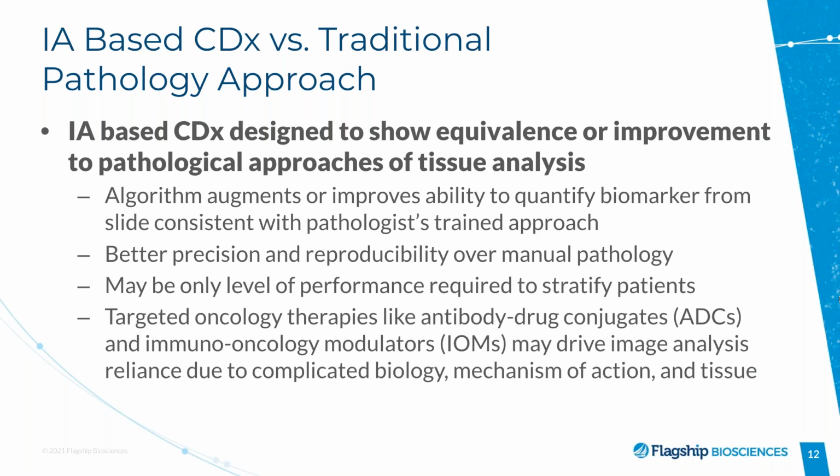So I think IA-based CDX is a way to really improve substantially over the way we currently look at slides. And from an oncologist's point of view, when we're thinking about staining a slide and deciding whether patients will get a life-saving therapy or not, it is critical that the answer be as accurate and as precise as possible. So that's the way I see IA, and as we continue to develop IA, I think it will eventually replace much of the manual assessment that we do today.